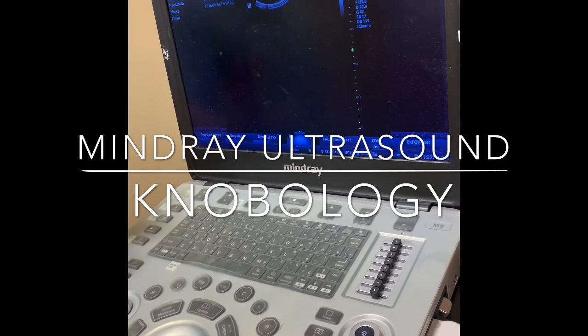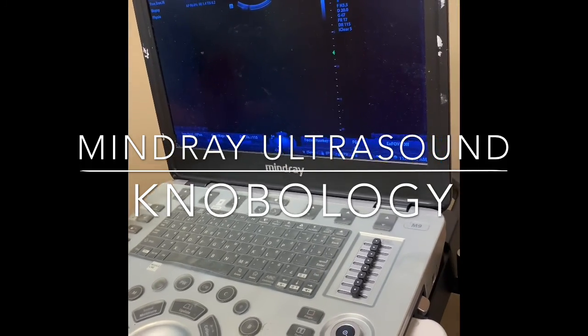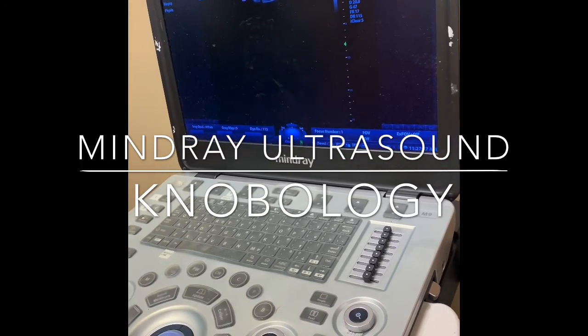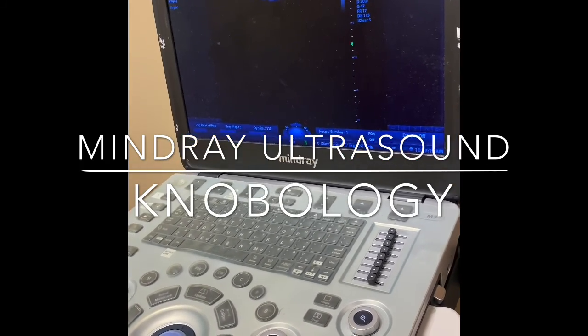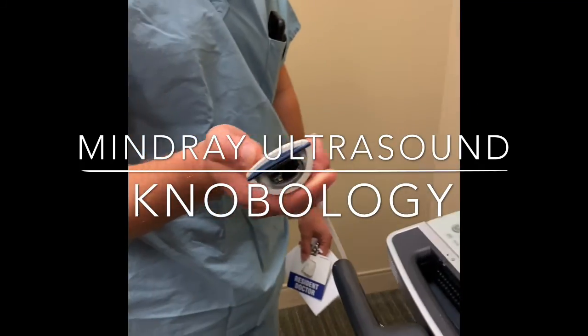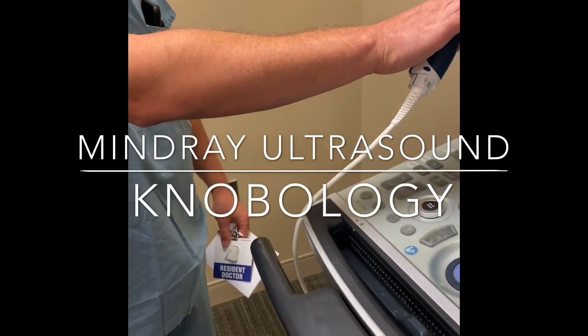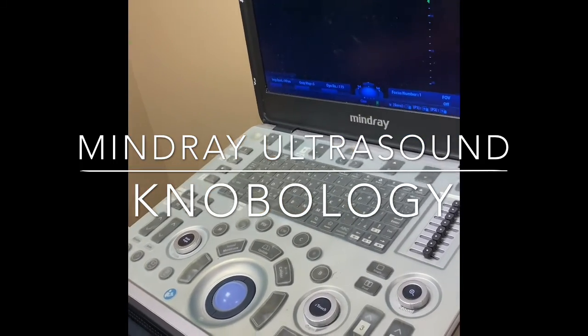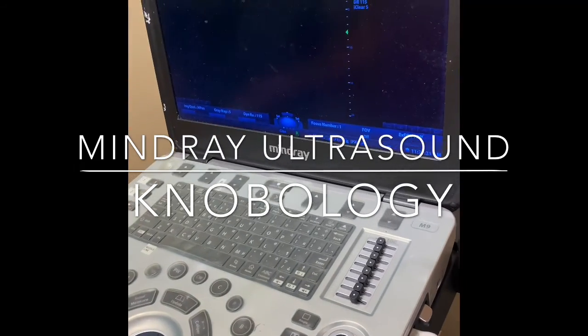Typically, during the course, while you're still in the patient room, registration is able to bring in the barcodes and the wristbands. What you can do at that point is use your barcode scanner, and right from the screen, you can go ahead and scan the patient barcode.